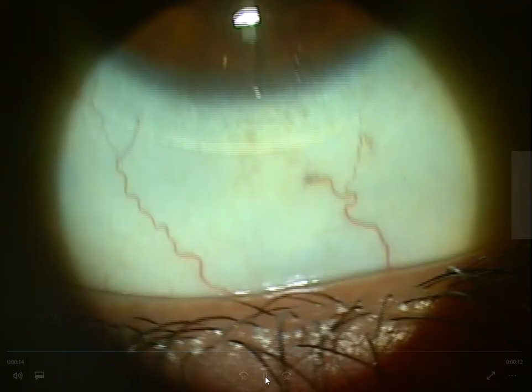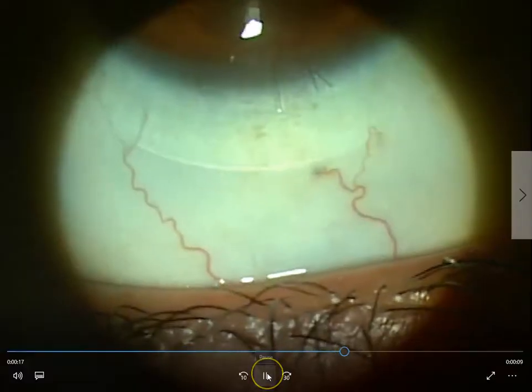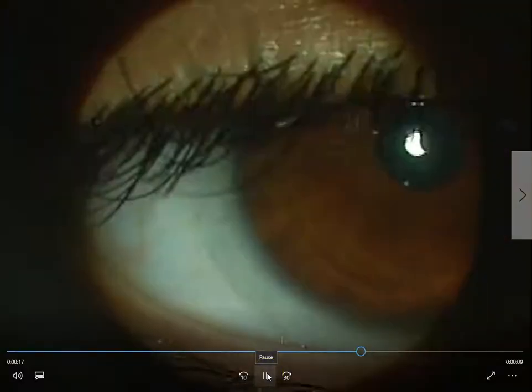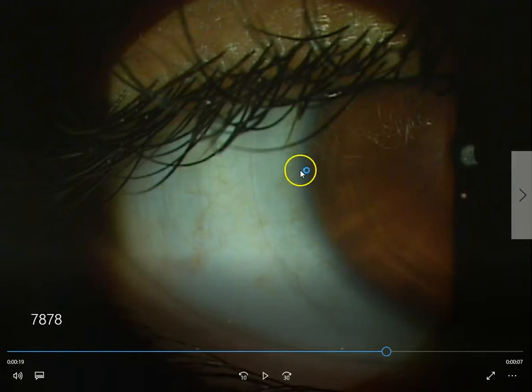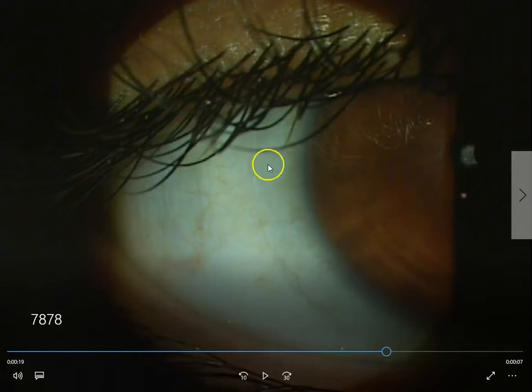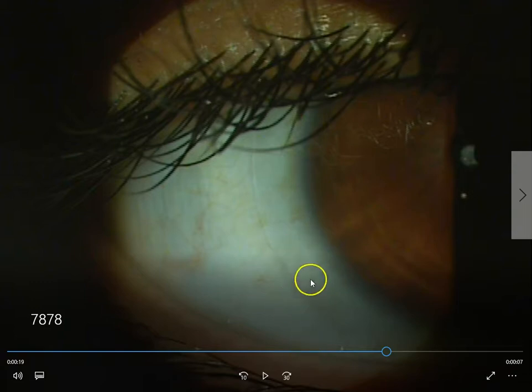Look at how the lens moves every time the patient blinks — you can see the lens moving. So we're looking for centration, which is the lens being centered in the eye, and we're looking for movement up and down, and we're also looking for the orientation.